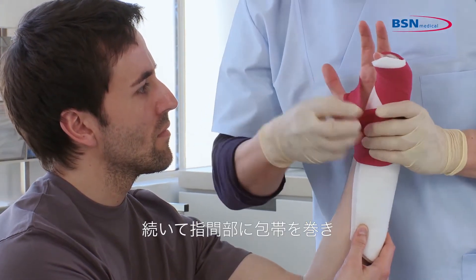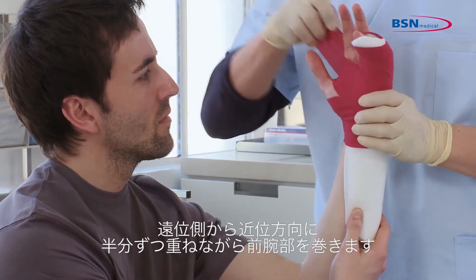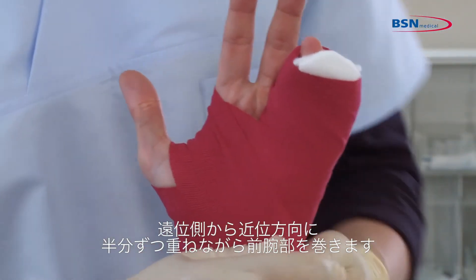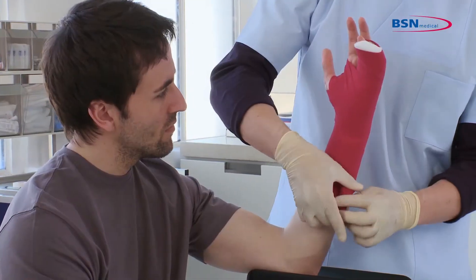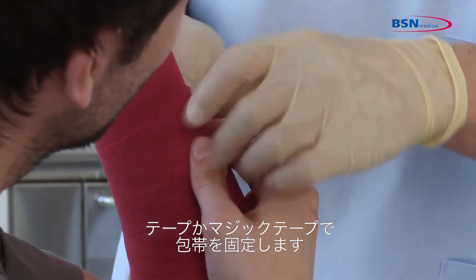Continue wrapping through the web space and work distal to proximal down the arm by overlapping 50% of the bandage. At the end, fixate the bandage with tape or a hook and loop fastener.